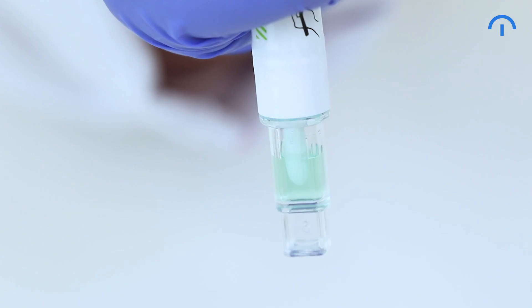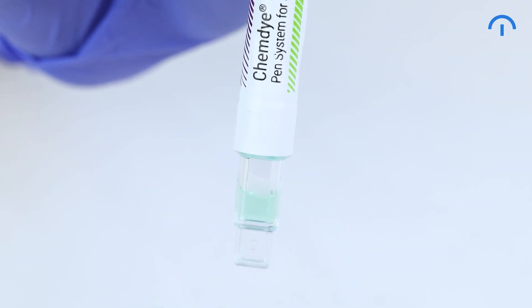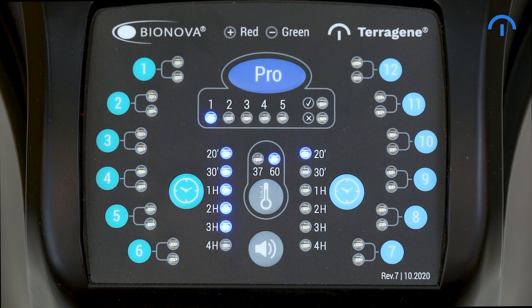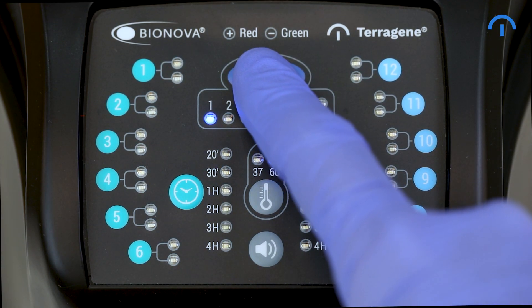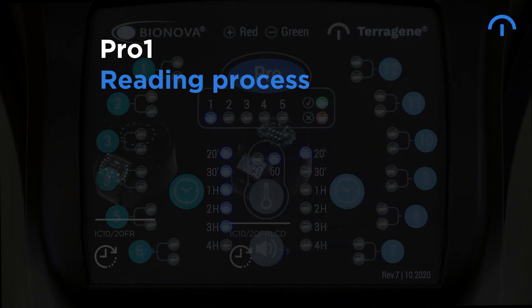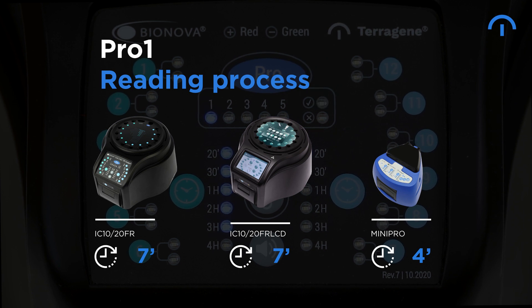Shake vigorously downwards for about 15 seconds until the solution turns green. Slide the swab upwards and shake the device again to ensure that all the liquid falls into the cup. After activation, the Pro-1 must be incubated immediately. Hold the Pro-1 button to enable the reading mode. Place the protein pen in the corresponding position, then hold the Pro-1 button for one second again to start the incubation and wait for the result. The Pro-1 reading process takes 7 minutes in IC1020FR and IC1020FR LCD incubators and 4 minutes in the Mini-Pro dedicated autoreader.